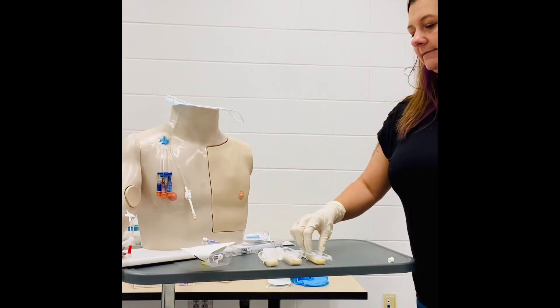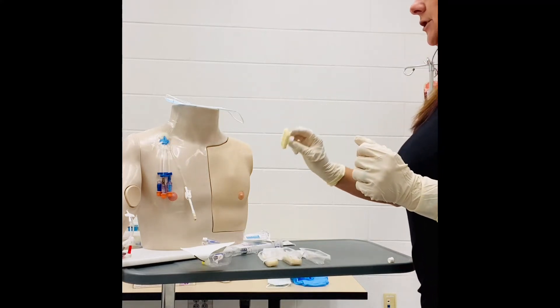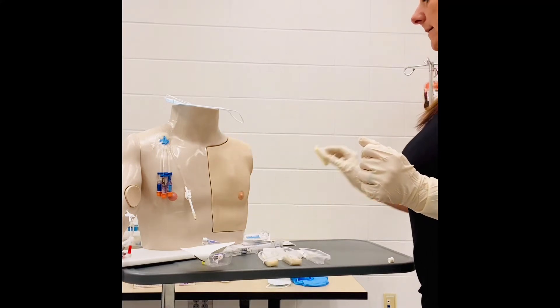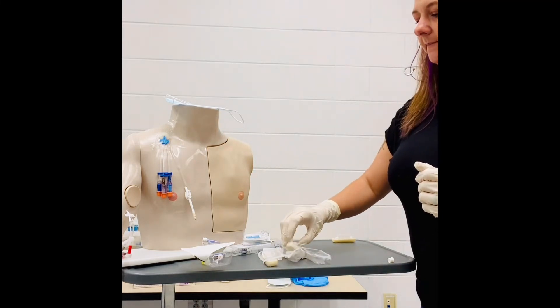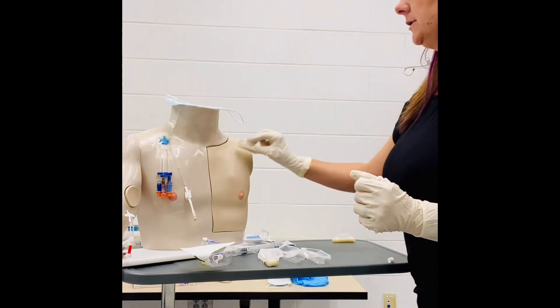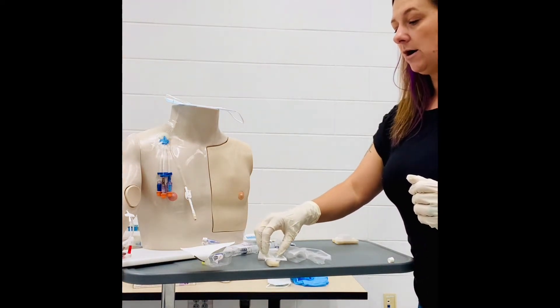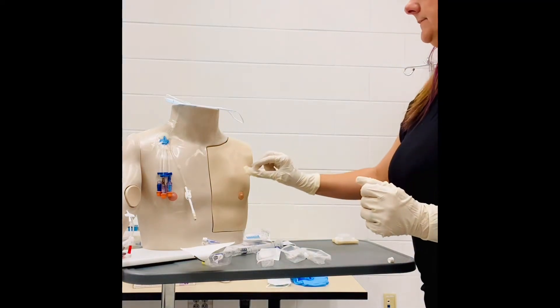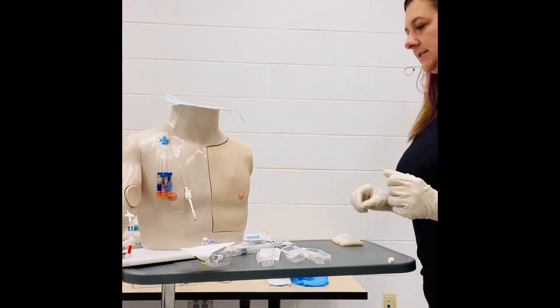First off, we want to clean. Take your chloroprep, pop it, and we're going to clean in a circular motion from the inner to outer aspect, then toss. We'll let that dry for just a few seconds. Take our second chloroprep, activate, and cleanse again from the inner to outer circle. Third, activate and cleanse again from the inner to the outer, and toss that in the trash as well.